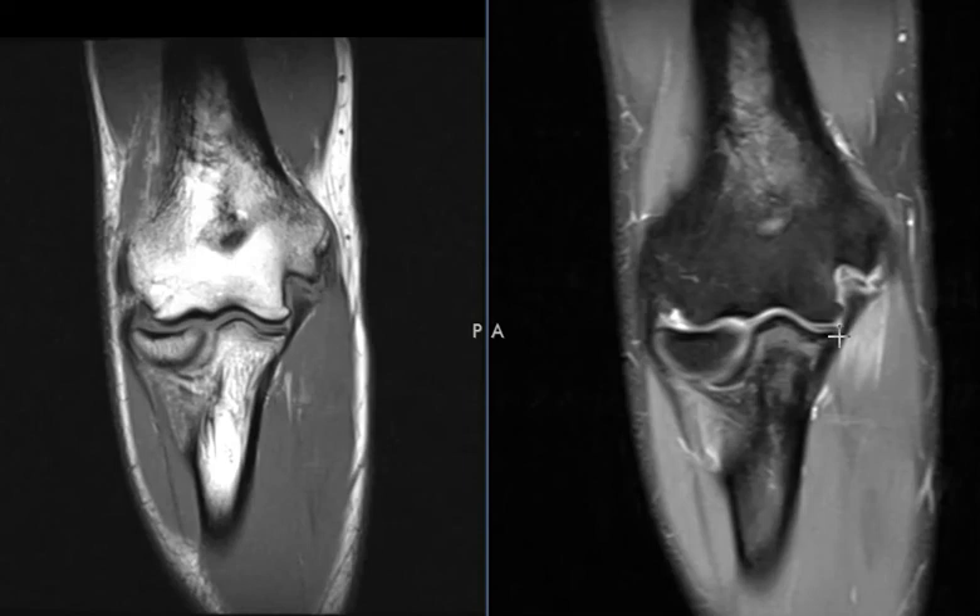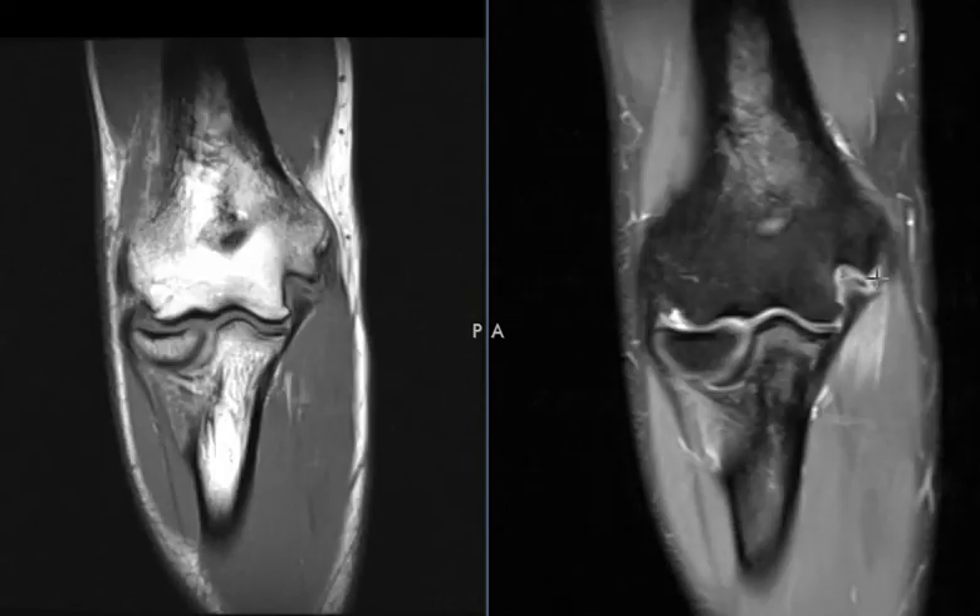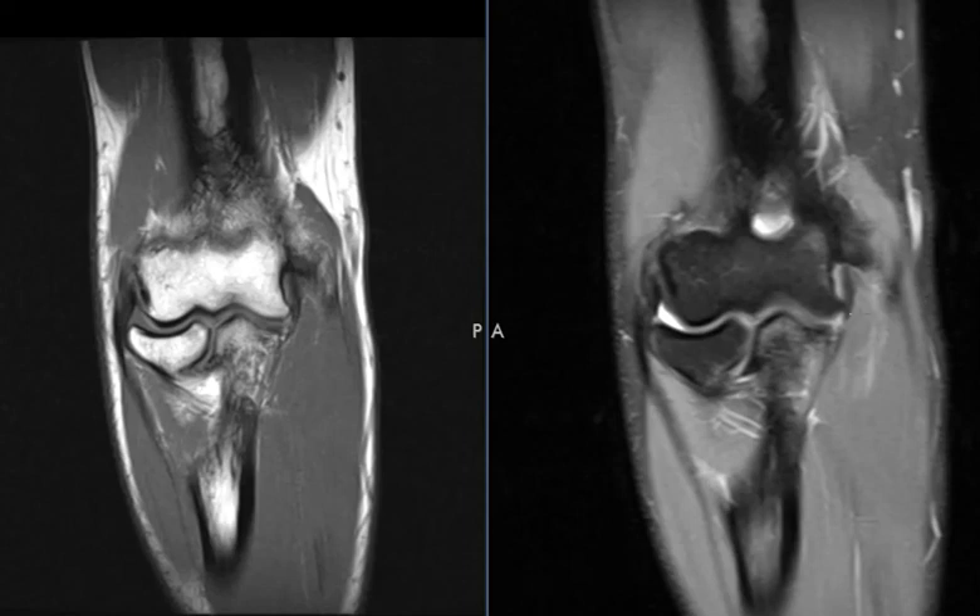A lot of times we see it torn right here at the attachment to the sublime tubercle, but less likely it's torn right over here to this undersurface. And that's it — a UCL injury involving the posterior band, and the anterior band right here looks good. Thank you very much.